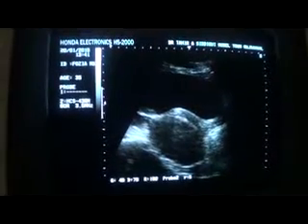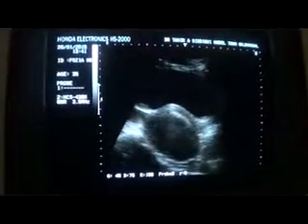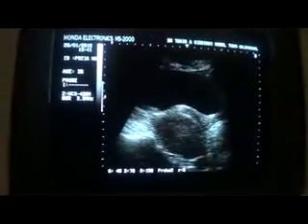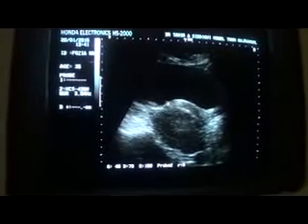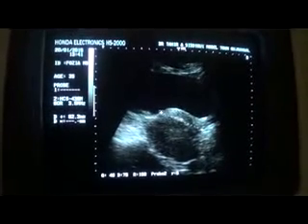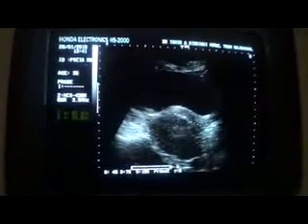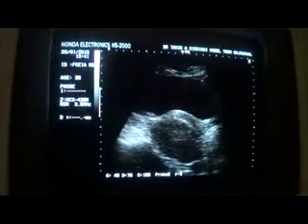This is a pelvic ultrasound of a 35-year-old fertile female with a history of menorrhagia. I am showing you the longitudinal section and trying to get the uterus. Now this is the urinary bladder, and this is the longitudinal section of the uterus, measuring 6.2 by 2.6 centimeters. Being nulliparous, the size is within normal, but at the low limits of normal.